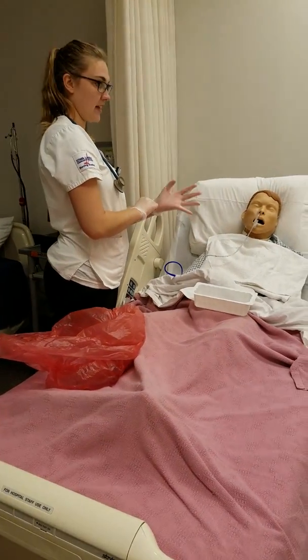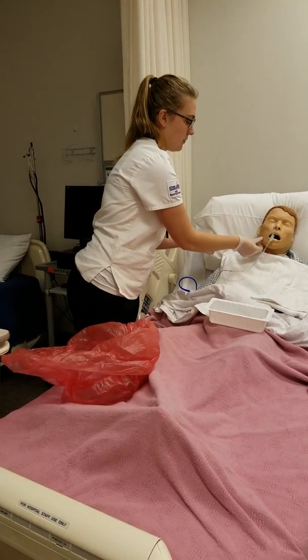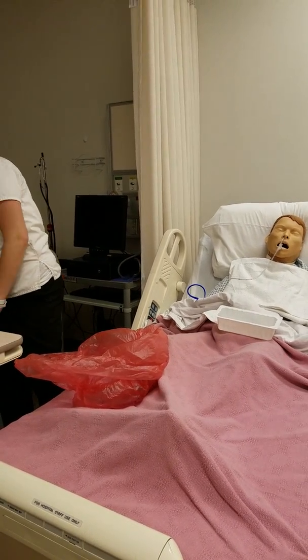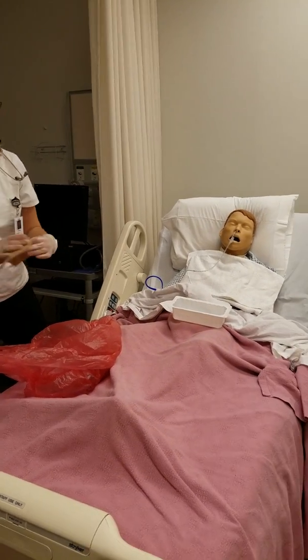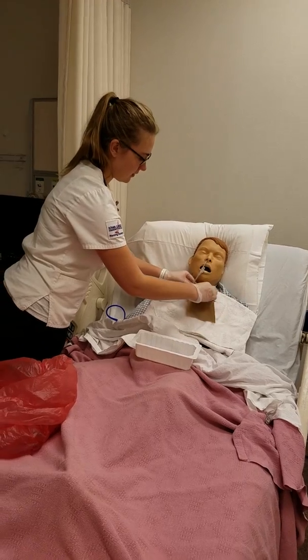All right, I'm going to begin now. And again, you're going to hold your breath until it's completely out, okay? First take this off. Okay. So you just step like that. And then I'm going to teach you for when you need to blow.